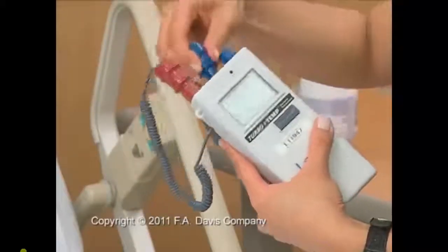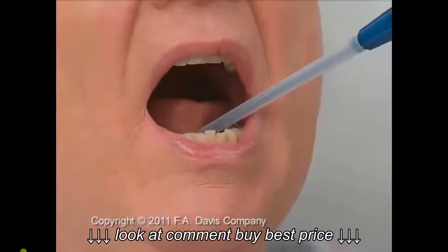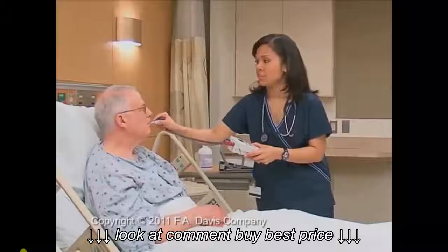Place a probe cover on the thermometer. Place the probe tip under the tongue in the posterior sublingual pocket. Have the patient close his lips around the thermometer, cautioning him not to bite down on it.